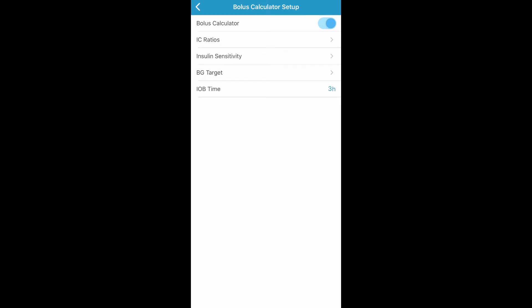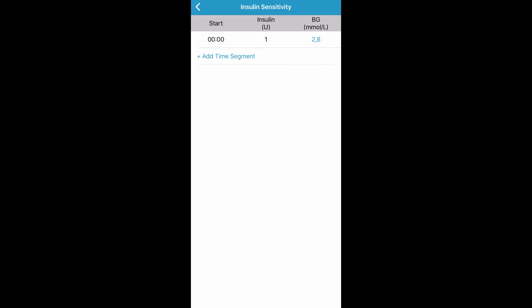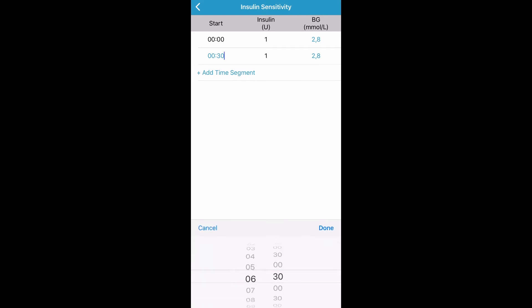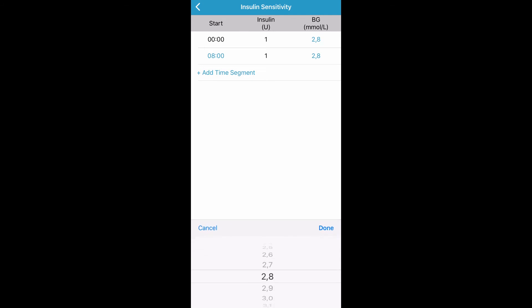Now you can set up your insulin sensitivity for your pump by tapping on Insulin Sensitivity. You can add up to eight different time segments for the day depending on your need for different insulin sensitivity at different times. Tap Add Time Segment to add a new time segment. You can adjust the insulin sensitivity for each time segment by tapping on the blue number next to each time segment. Now tap Done. Once you have entered your insulin sensitivity, tap the back arrow.